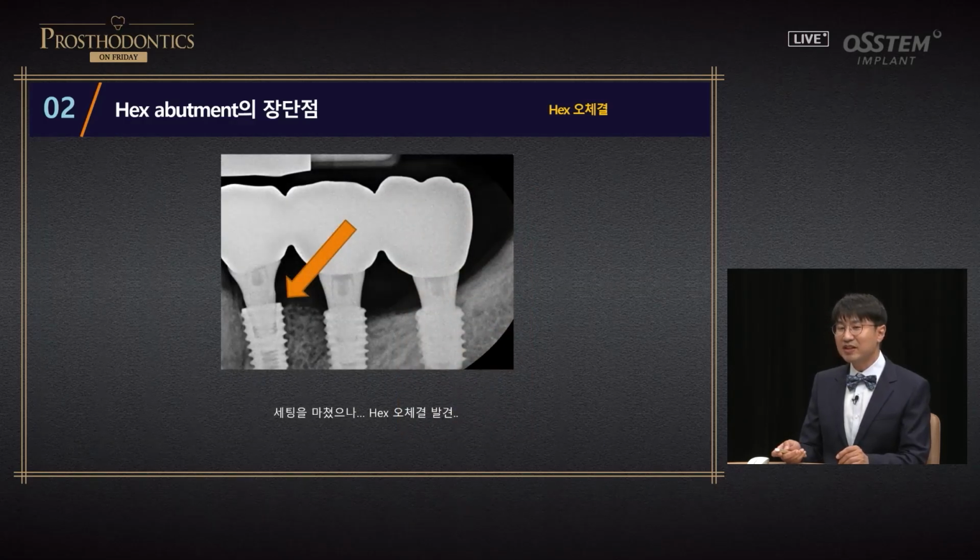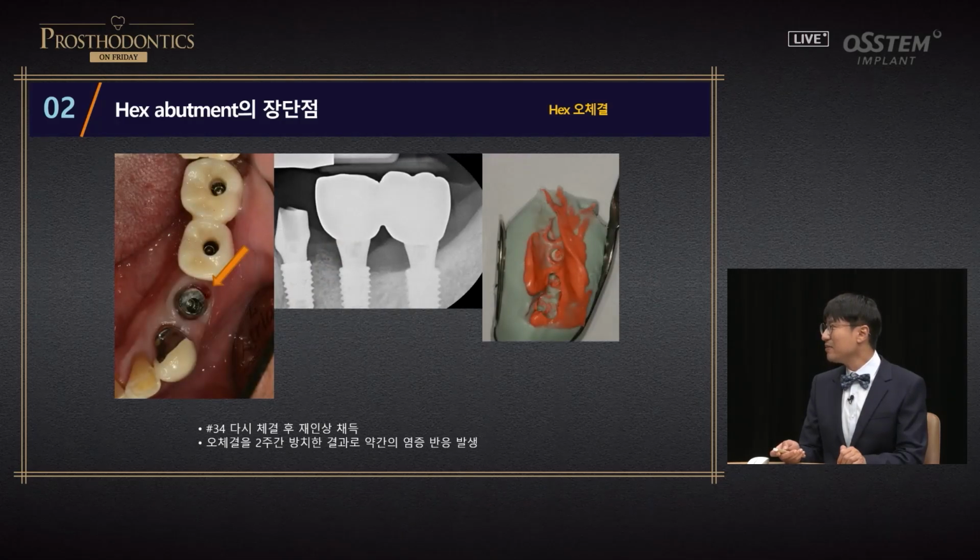This is a case where I helped a dentist in Yeosu. In a 3-unit prosthesis, I did it together and I found wrong connection after completing setting. I removed it and did it again to provide corrected connection. You don't need to ask your friend. Don't feel conflicted. Just remove the prosthesis and provide a new one with corrected connection. This needs to happen.